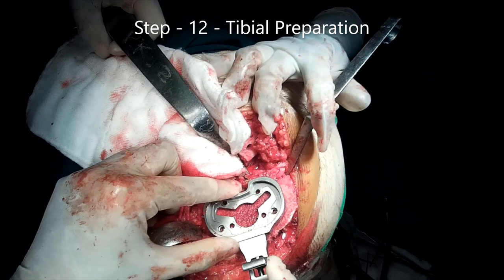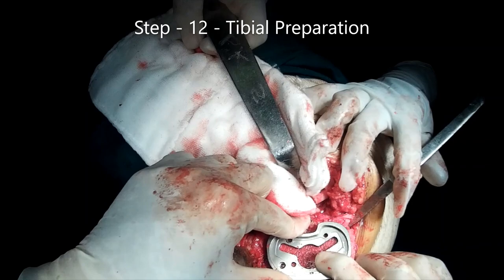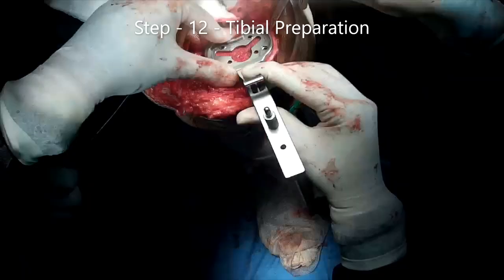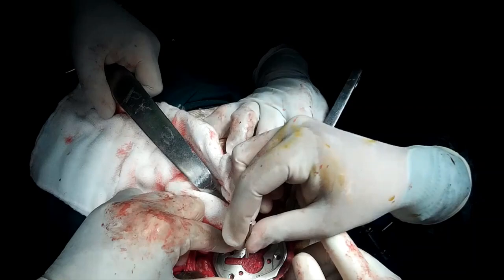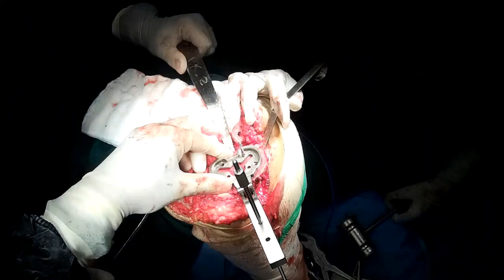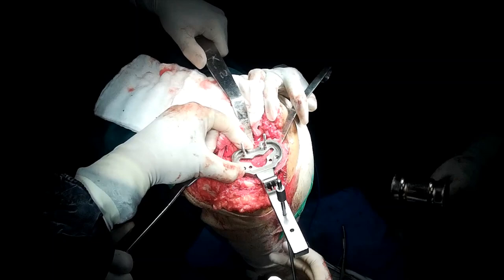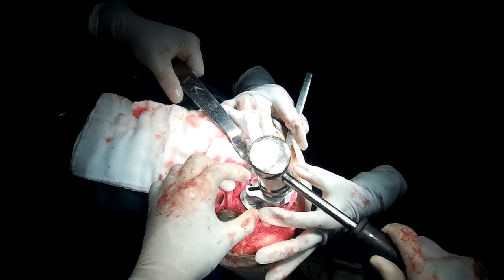Now tibial preparation is started, in which we place appropriately sized tibial base plate on the resected surface of proximal tibia. We use tibial alignment rod through the tibial tray coupler to adjust the rotation of the tibial base plate, confirming the alignment and rotation of the tibial base plate.